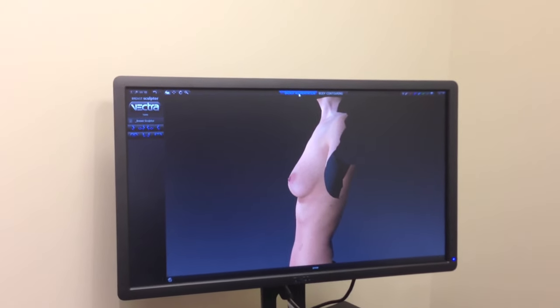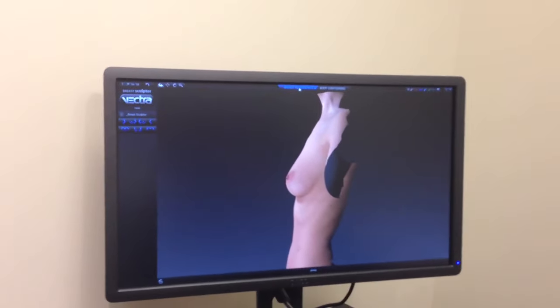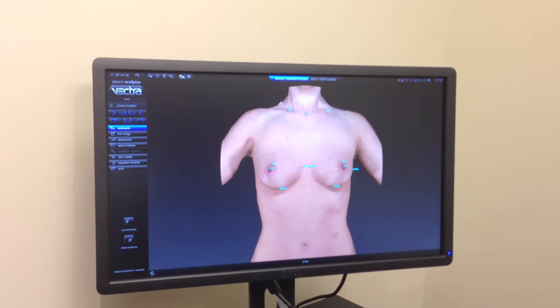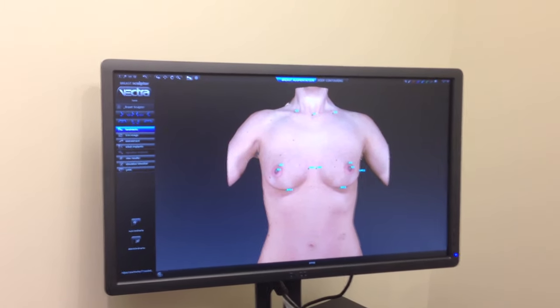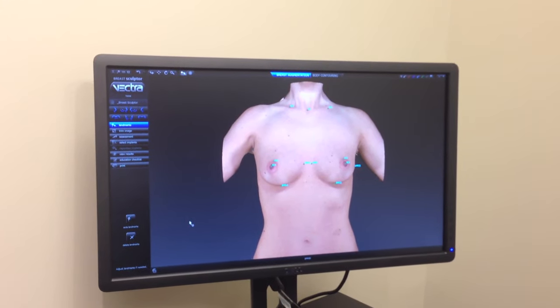So, we're going to go to the breast augmentation scenario for the Vectra and on this you can see that the camera device basically shows all the important key landmarks of the patient. They show the nipple position, where the natural fold is, relative to the clavicle, how much droop it has and so on.